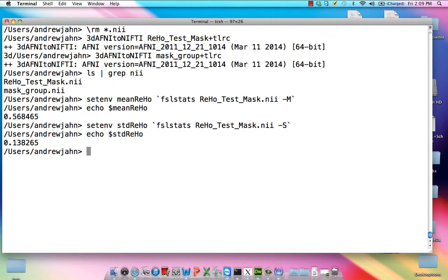Okay, and again, this value is very similar to what we got before. And now that we have that, we can use both of those to calculate a normalized regional homogeneity map. Now, to do this, we're going to use FSLMaths, similar to 3DCalc.